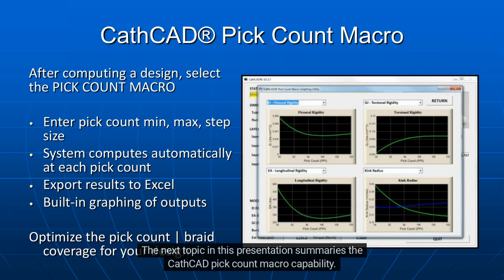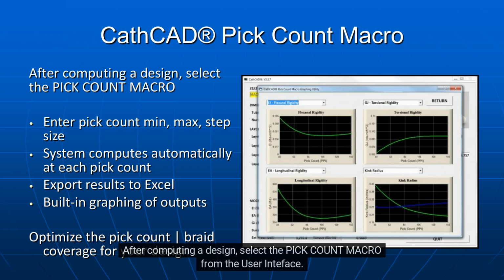The next topic in this presentation summarizes the CathCAD pick count macro capability. This macro allows the user to optimize the braid coverage in the catheter design very quickly. In order to execute the pick count macro, the following steps are to be followed. After computing a design, select the pick count macro from the user interface.